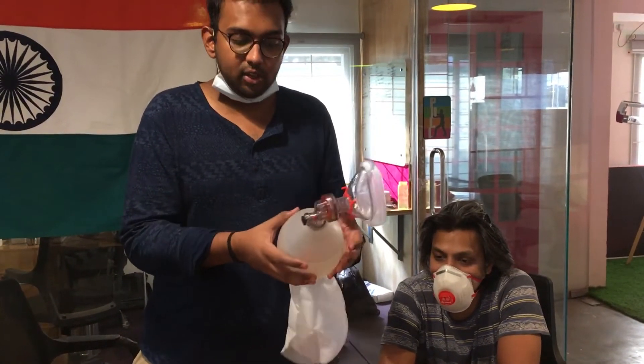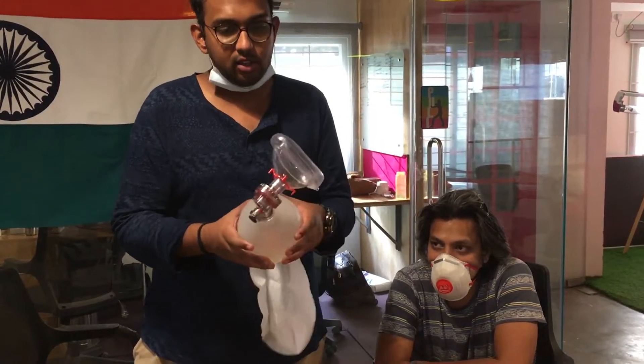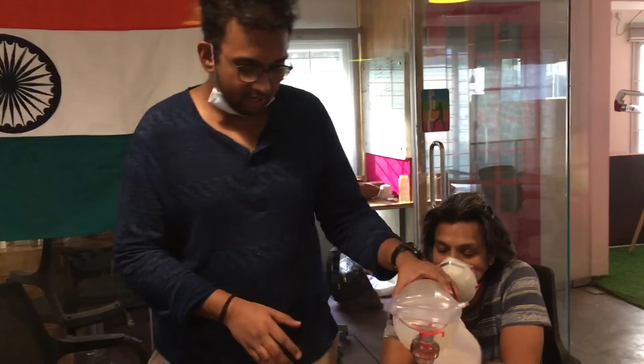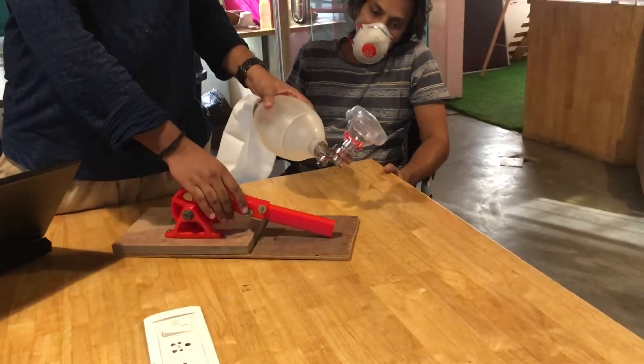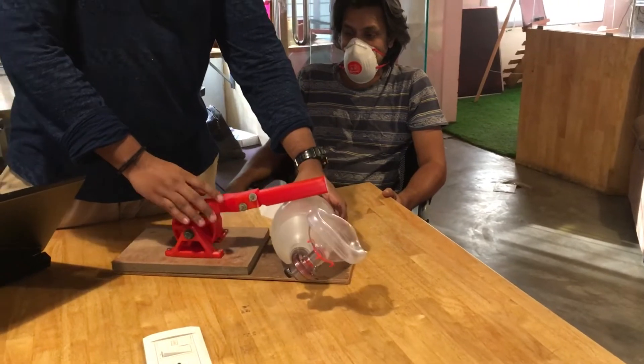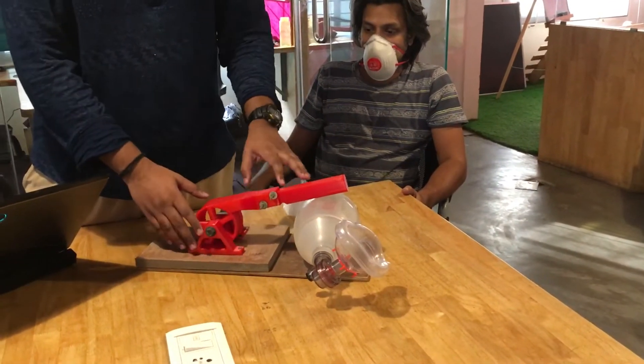What we are trying to do is automate the manual resuscitator part of it by using an arm that we have completely designed in-house. It is 3D printed right now, and the entire print time takes under 12 to 14 hours, which means all of this is custom designed.